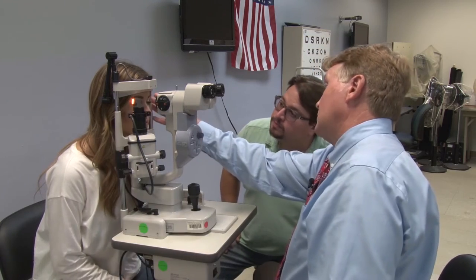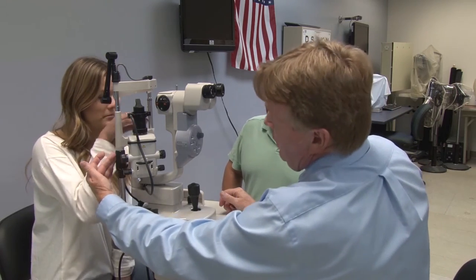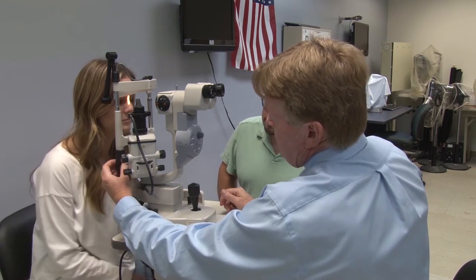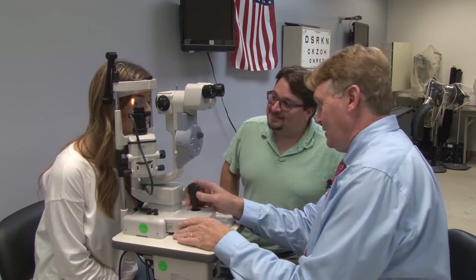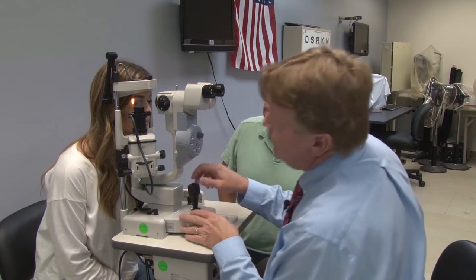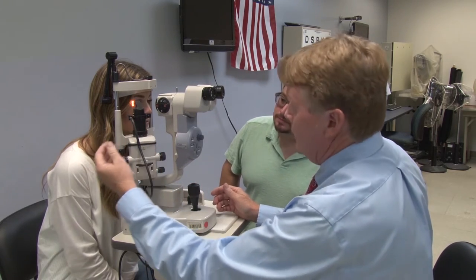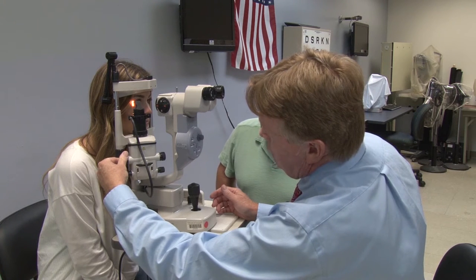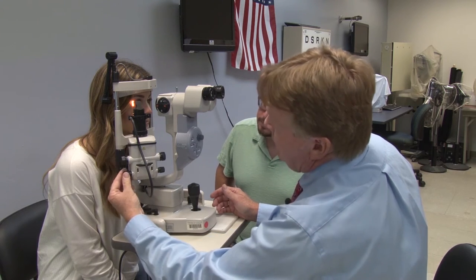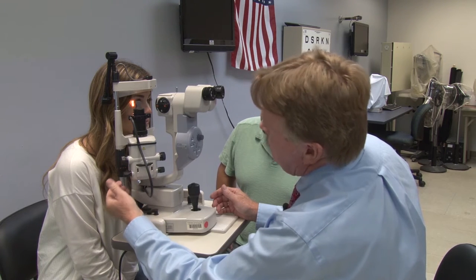You can see there's a mark on this side as well. She's a little bit low at this point, so we can use this black knob to adjust. Before we start, we want to make sure that we have a moderate-width beam — we can control the width right here — and we want to use one to two millimeters. We're going to leave it on the full vertical height at 14 millimeters. We make sure the beam is straight up and down so that it's not rotated.